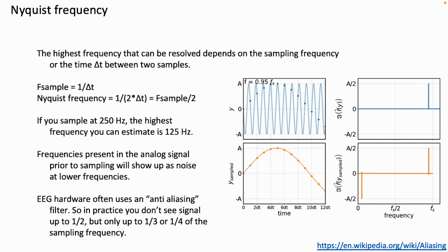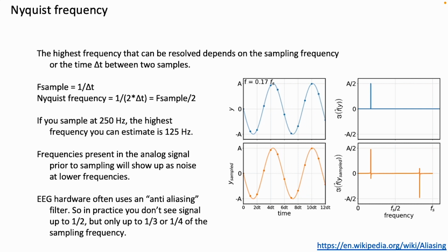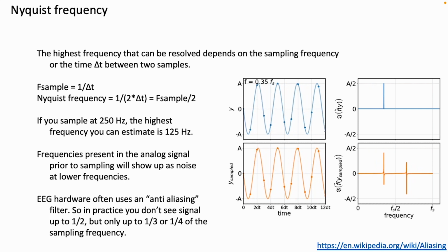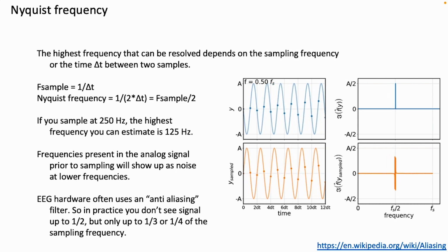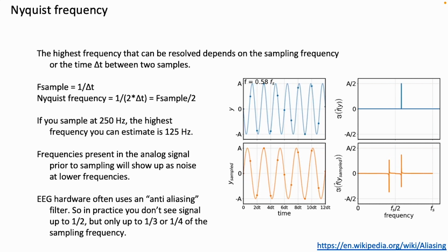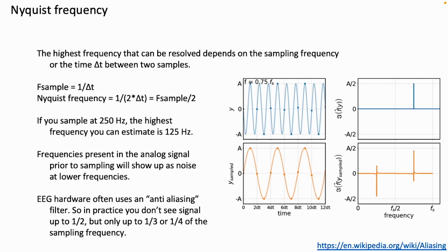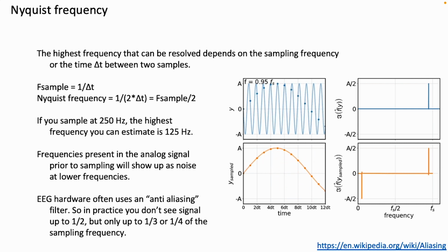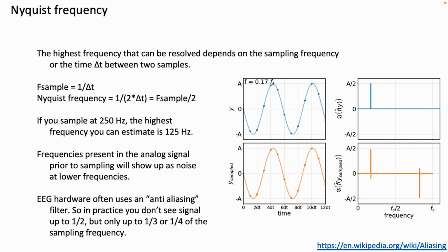Any questions about this? This is really an important consideration when you're going to get an EEG amplifier, and it's something that you have to keep in mind. Sampling at high frequencies gives you more freedom to see all signals, including the artifact signals. But sampling at high frequencies also results in larger files, so processing is going to take longer, and there's often this trade-off.